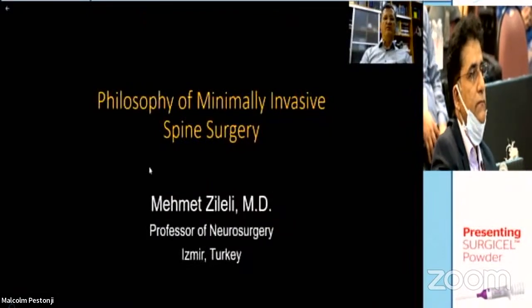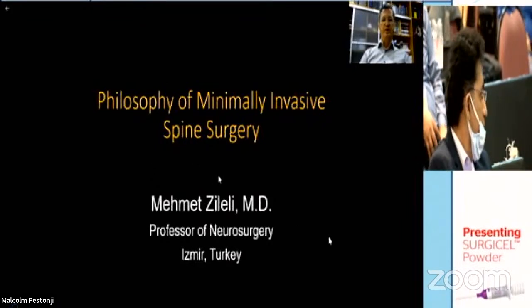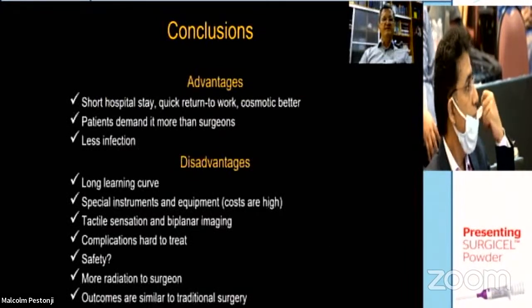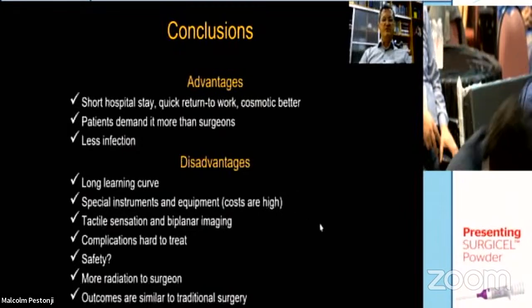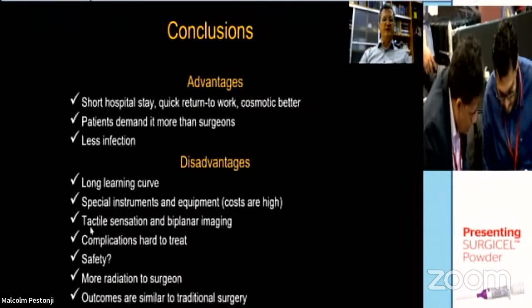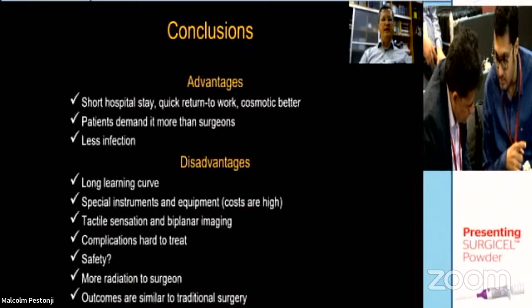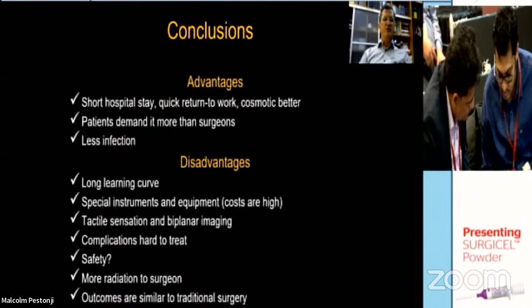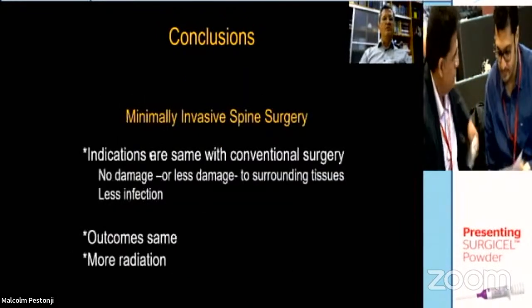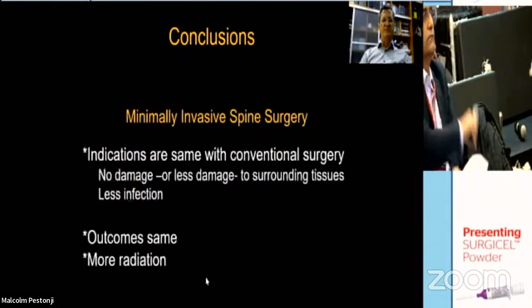This talk will be dealing with the philosophy of minimally invasive spine surgery. This is my conclusion: it has significant advantages, but it also has some disadvantages like a long learning curve, need for special instruments and equipment, loss of tactile sensation, complications that are hard to treat, safety measures, and more radiation to the surgeon and surgical team. What is held is that the indications are the same as with conventional surgery, outcomes are the same, with more radiation.